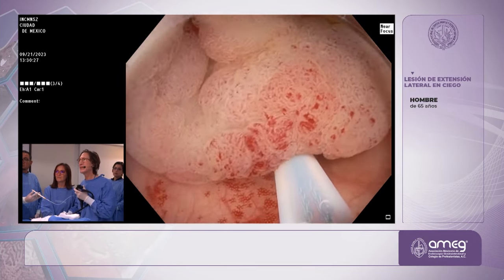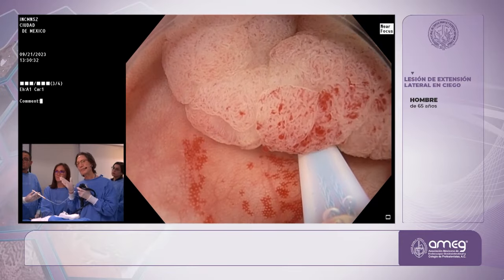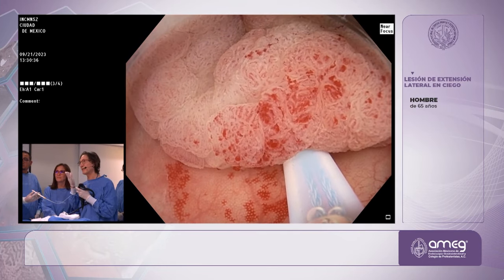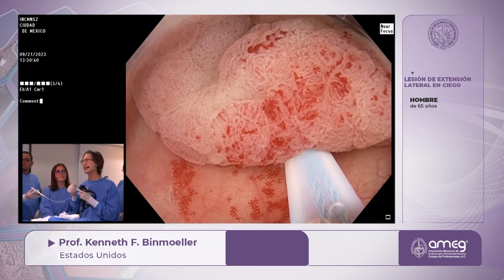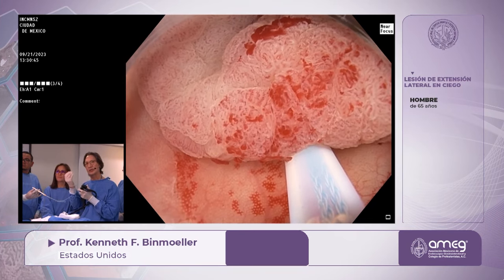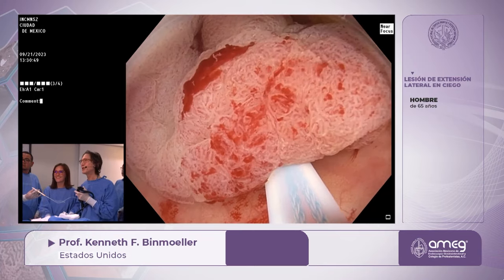So now I'm just looking, trying to rotate like this to make sure I got it. The other thing I'm looking at is the color. So you want it to turn a little bit. If you really got the whole lesion, it should change color. It should turn violaceous. So he's snugly closed. You notice it has a little bit of a violaceous hue. So it looks good. So I think we're ready now to do our cut.